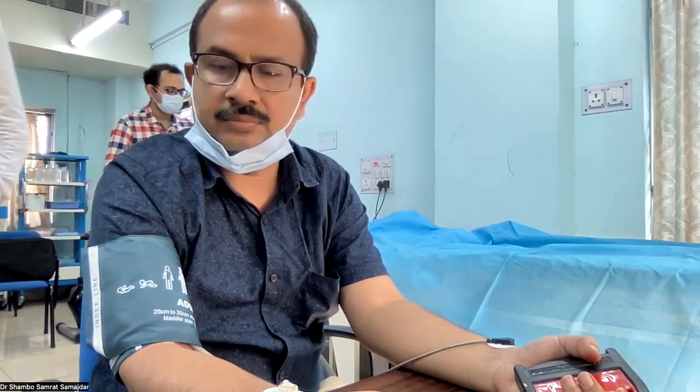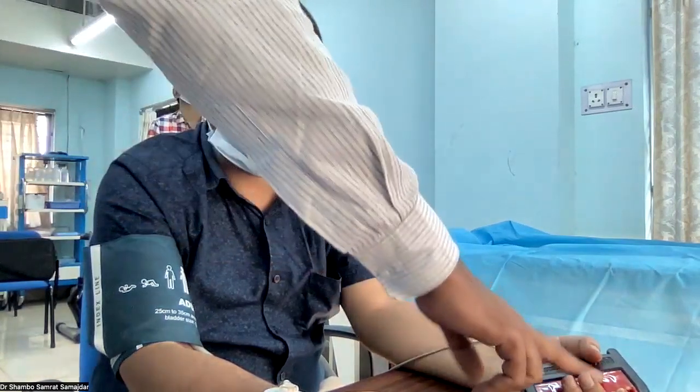When I say, I will ask you to squeeze this red bar as tightly as possible for 15 seconds, until you record. Here is a little modification. We are asking the patient to hold it maximally, but ideally we should ask the patient to hold it at 30% of his maximally tolerated pressure for at least 3 to 5 minutes. We need to check the blood pressure, specifically the diastolic value, and calculate how it changes from baseline. But in this particular machine, the standardization is done a little differently. Done. Relax.